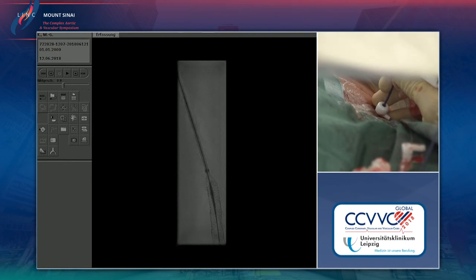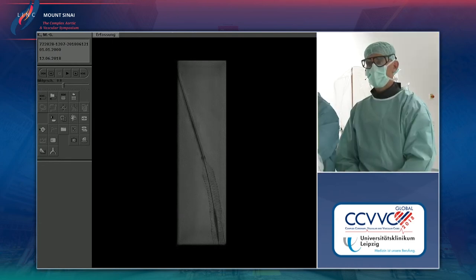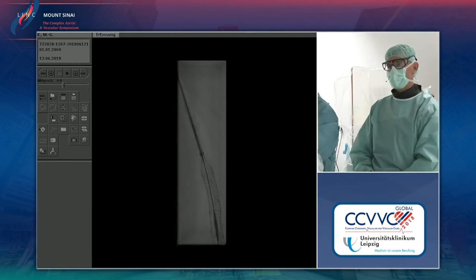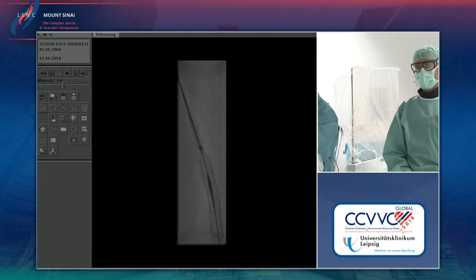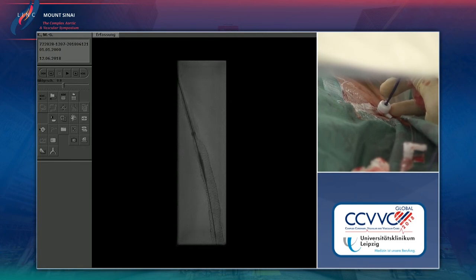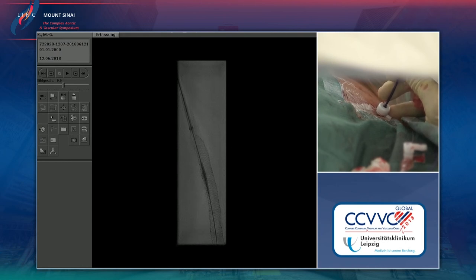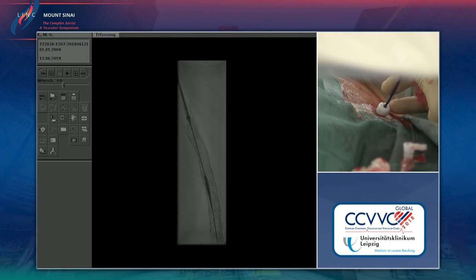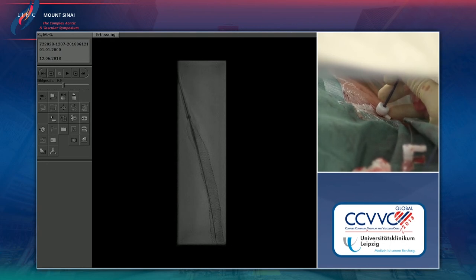For the audience not familiar with the Supera stent: this is a beautiful demonstration. Every stent ring is tying along the way — that's beautiful apposition in heavy calcium. It really does take a slow deployment to get that kind of result in heavy calcium. There is no nitinol stent that will look like this stent does right now in calcium. It's a beautiful technique by Sven.